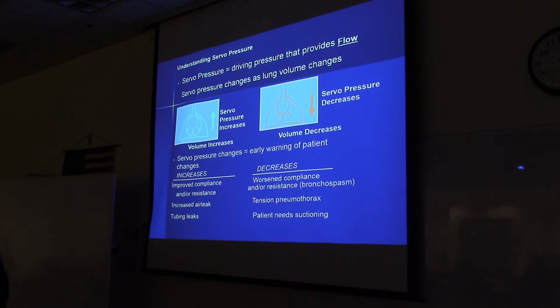No, while he was monitoring the neonate's pressures, and he went up on it, she was at 3.1. He says that was different, that means that she's barely ventilating, because before she was at around 2.7. That was an increase, and he was like, that's much better, because he went up on her pressures on the jet ventilator, and her servo pressures also increased.